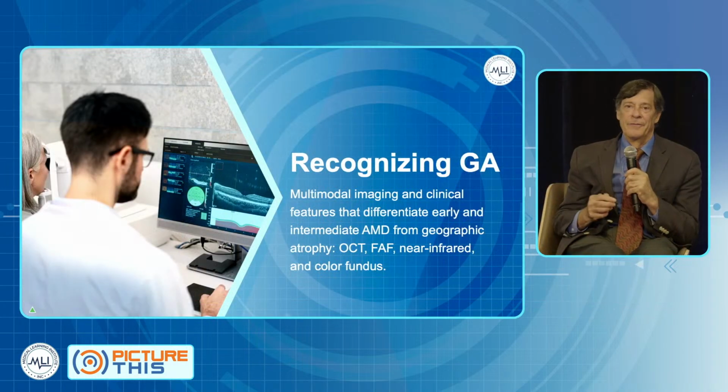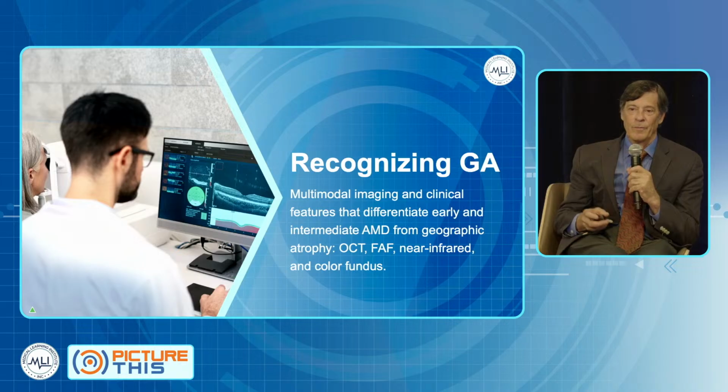So Glenn, why don't you tell us about imaging techniques needed to recognize geographic atrophy? Yeah, so how do you actually identify geographic atrophy, and what are the methods that you use to do that? Well, I like to use a multimodal imaging approach, meaning that I'm using different imaging modalities together to come up with the diagnosis and also to monitor the patients as well.